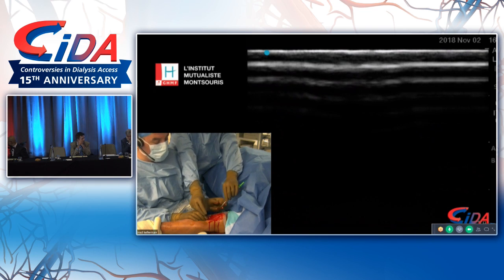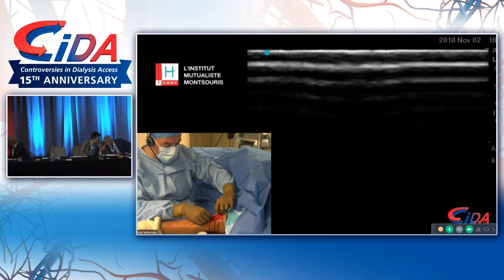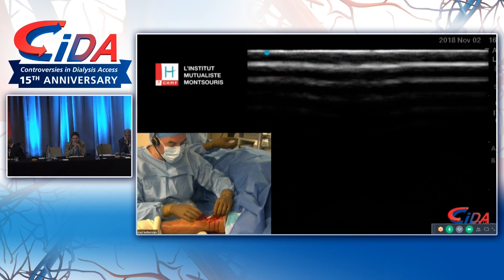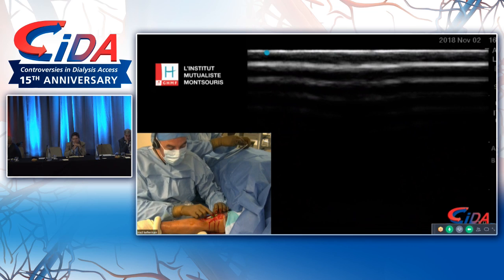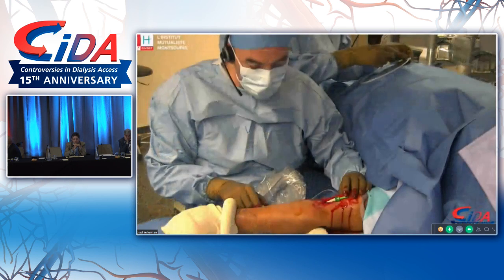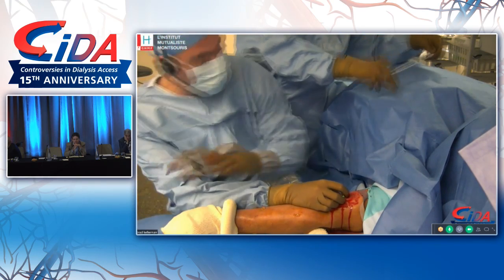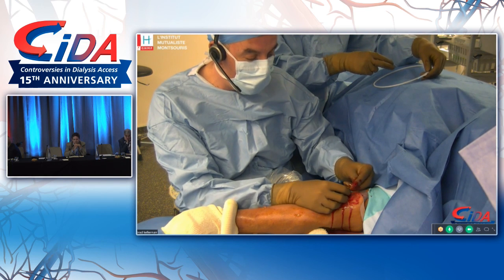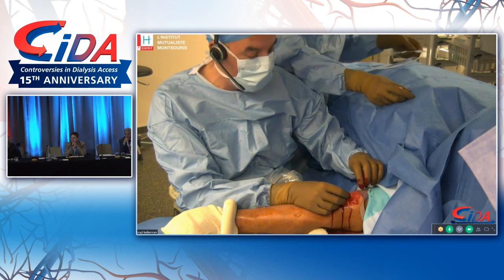So we're about 2 or 3 minutes after the beginning of the case, and the toughest part is already done, which was basically the puncture, and doing the puncture neatly without having any hematomas that might make the view a bit more difficult. I'm going to use, as you see here, the dilator of the sheath. This is a 6 French slender sheath. I'm going to use a dilator to exchange the wire. I'm going to take the 021 wire off, and I'm going to put the 014 wire that we need for the device. This is an 80 centimeter 014 wire that's going to go in right now.